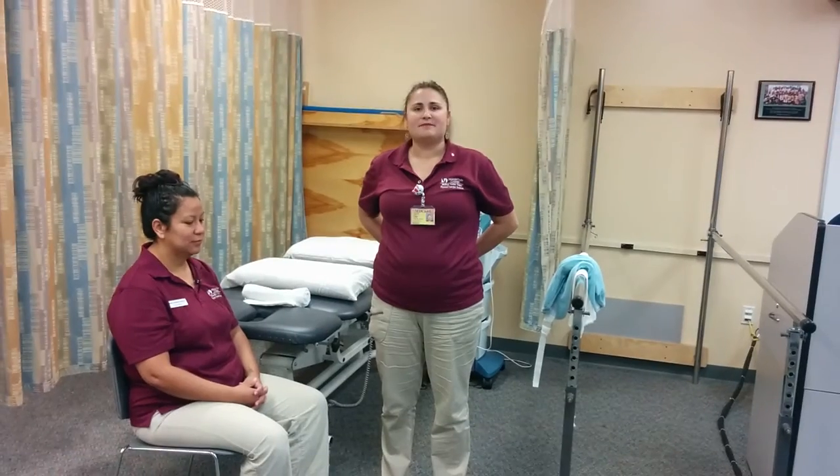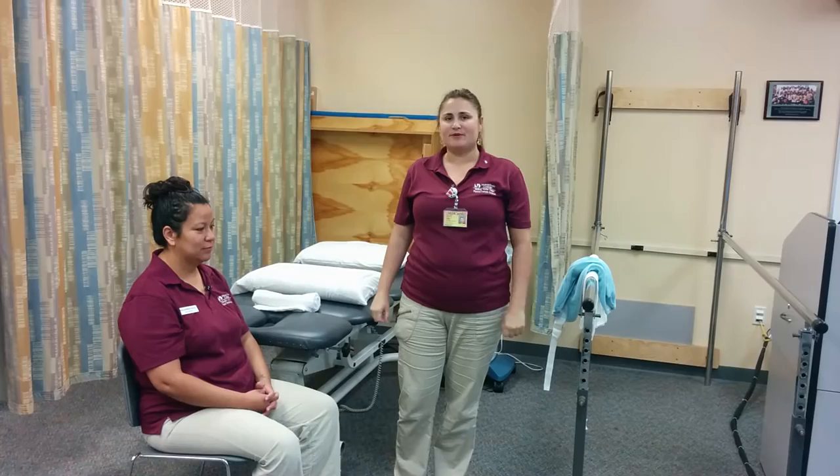Hi, my name is Diana Lopez and I'm a student of physical therapist assistant at Miami Dade College. Today we're going to demonstrate how to apply a hot pack to the cervical area.